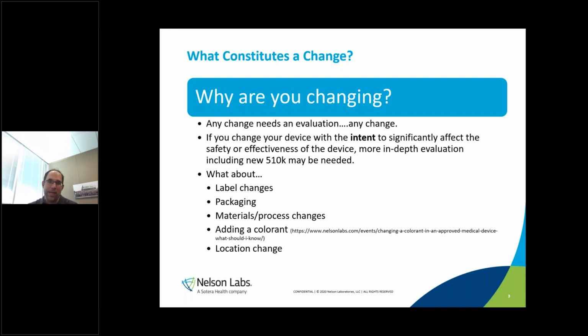And we recommended doing a cytotoxicity test. Well, maybe surprising, maybe not. The new manufactured device failed cytotoxicity and the old one passed, right? So they did a comparison. And so they did some chemistry to evaluate the reasoning, the difference between those two manufactured parts. And we found one chemical in the new part that wasn't in the old part.